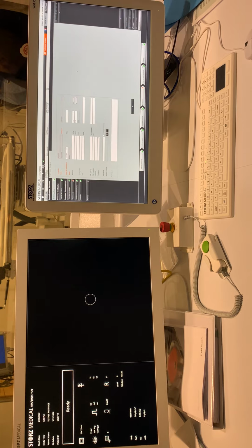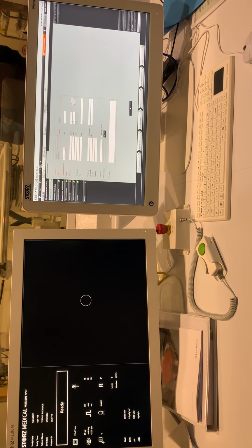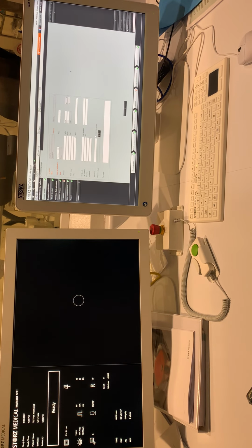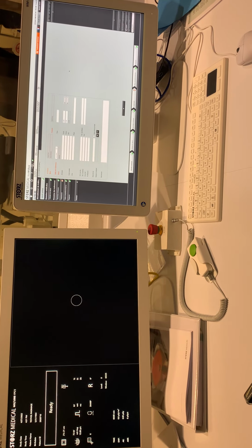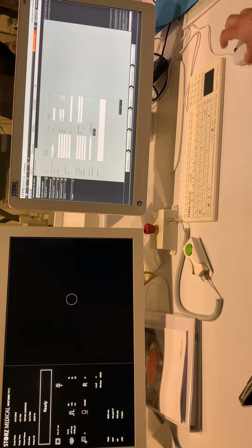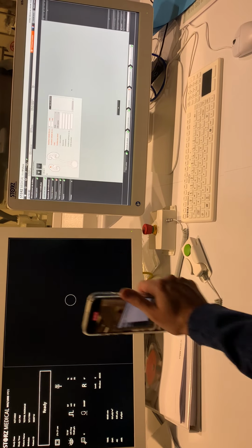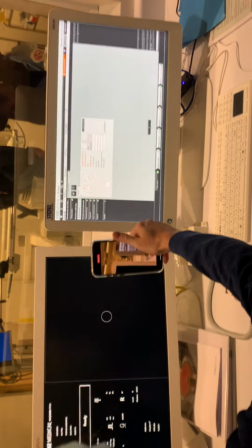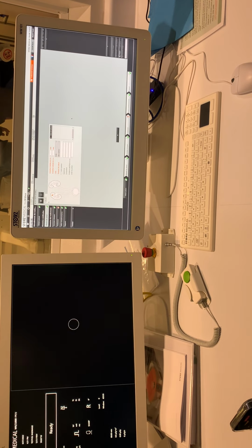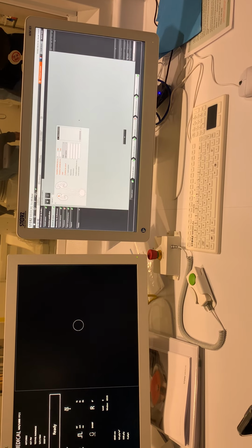For example, it is starting directly on the main page for patient details. Here you can enter address, weight, height, and all of these things if you need it. If you go to the next page, we saw this page already. These are our stone details, so you'll always be able to change your stone details again.